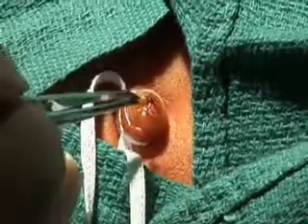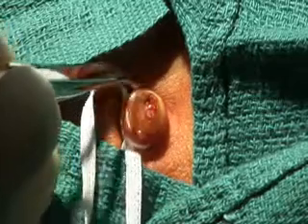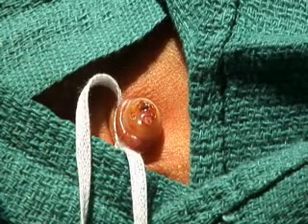It is feasible for a single operator to place an umbilical catheter successfully. However, we will describe and demonstrate the procedure for the operator working with an assistant donning sterile attire.